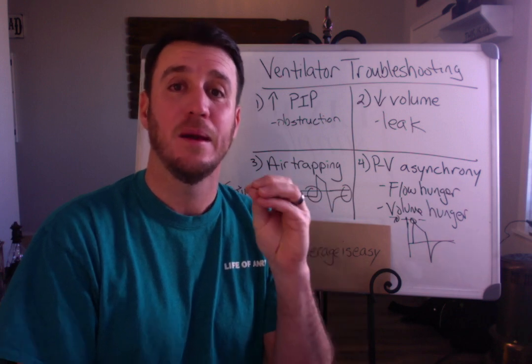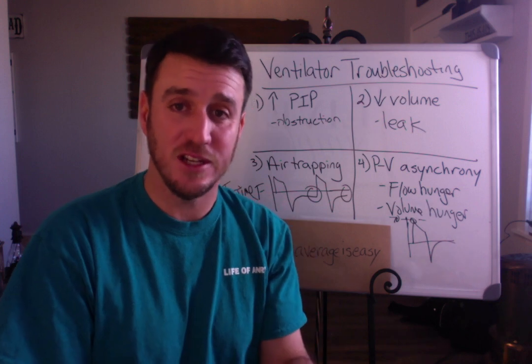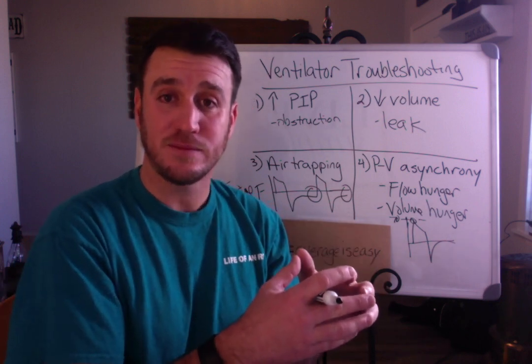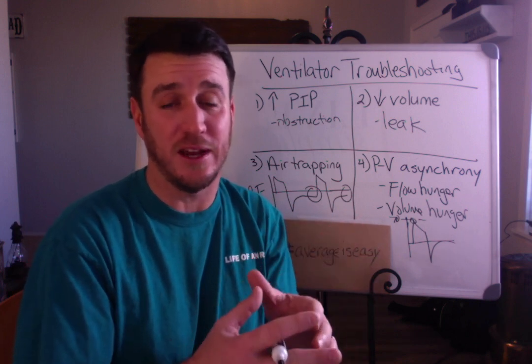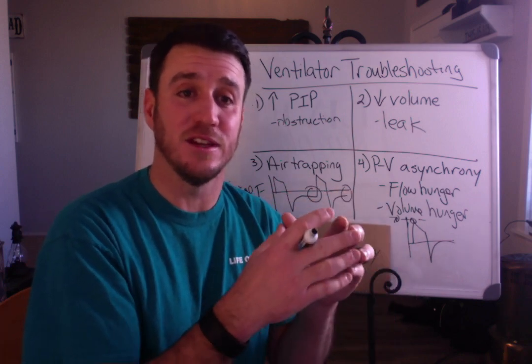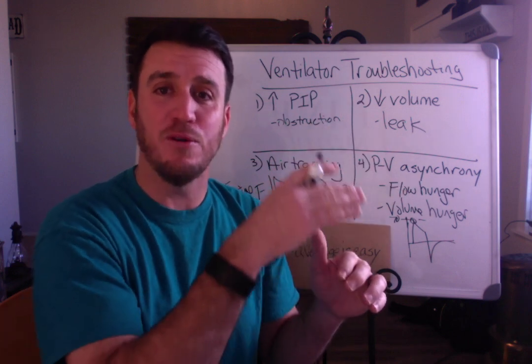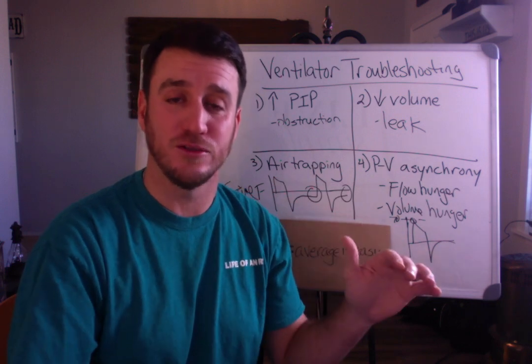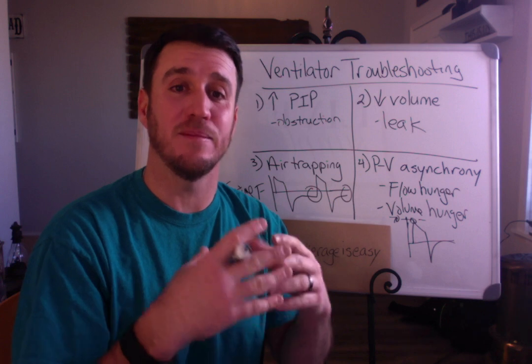You've got to talk to your team, your physician, and say, hey, this isn't working. Our patient is asking for tidal volumes in the 460 range, but we only have them on 400, and the result of that is that they're ending up getting 800. They don't want 800, they just want 460. But we're cutting them short at 400. So you've got to make this understandable.